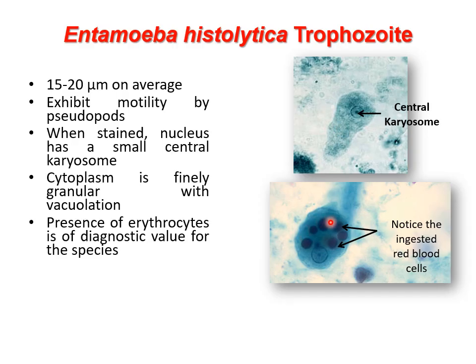And more importantly, when you look at trophozoites of Entamoeba histolytica, you might see several red blood cells inside the trophozoite. On this trophozoite, for example, you can see 6 RBCs that were ingested, as well as the nucleus that contains the central karyosome. Remember that the diarrhea caused by Entamoeba histolytica is bloody, and this is called dysentery. This is mostly due to the lysis of the intestinal mucosa by the trophozoites, leading to this bloody diarrhea. Of note, these trophozoites feed both on RBCs and on bacteria of our intestine.